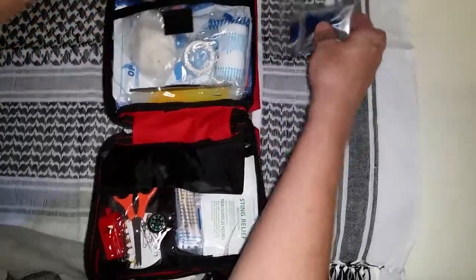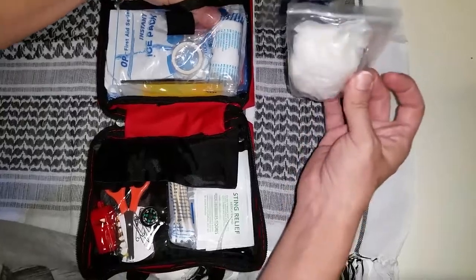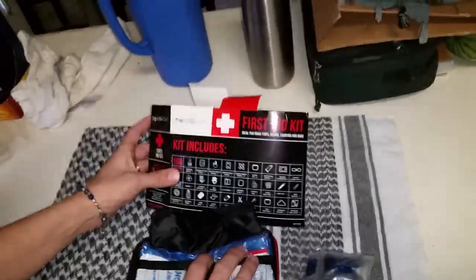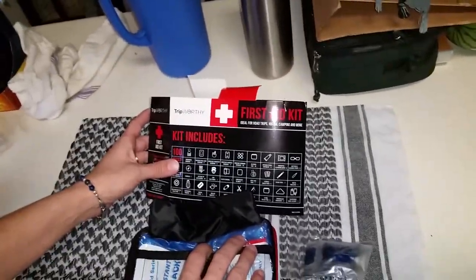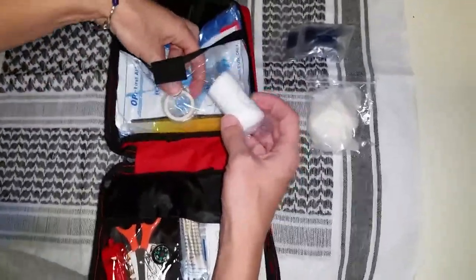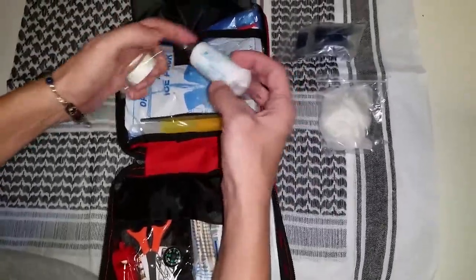CPR mask. A pair of gloves — that is one pair of gloves. When looking at the back, it does only have one pair of gloves. That was the one suggestion I would have: you always want to have one extra pair of gloves, so if you come across an accident or if you're in one, you always want to have more than one pair.